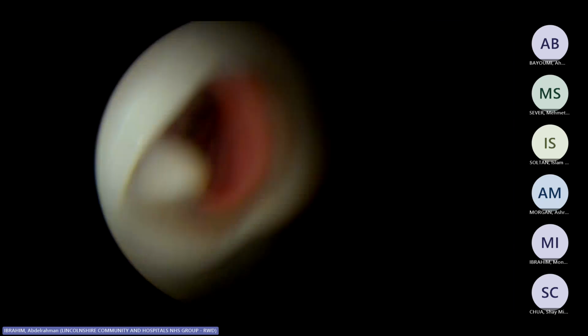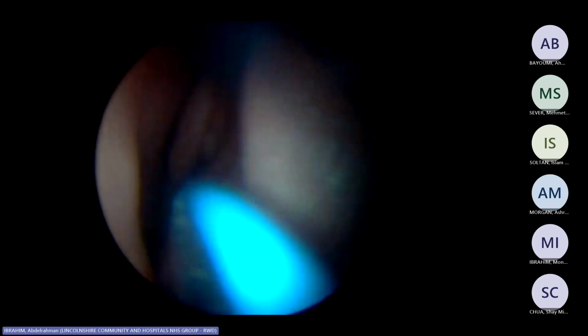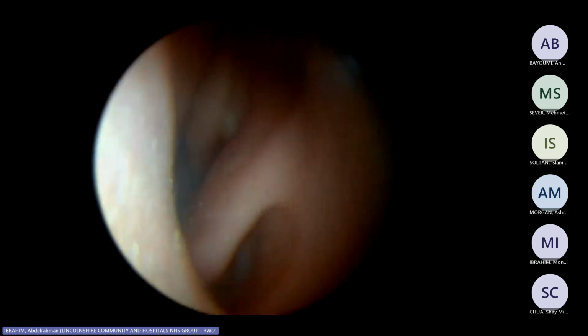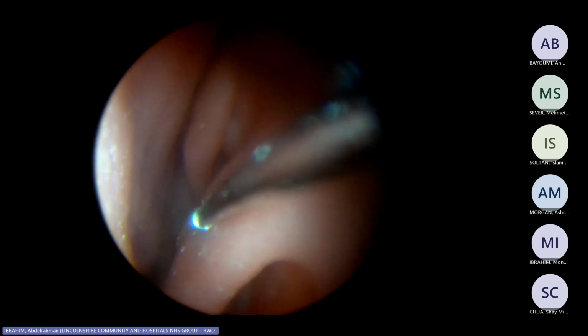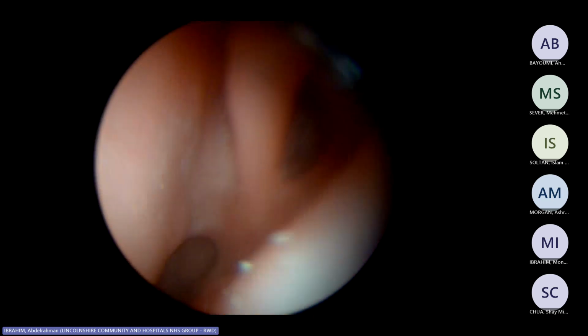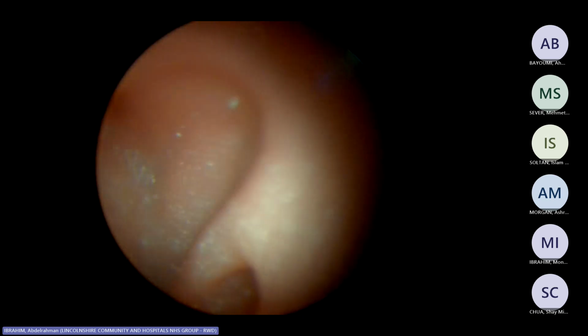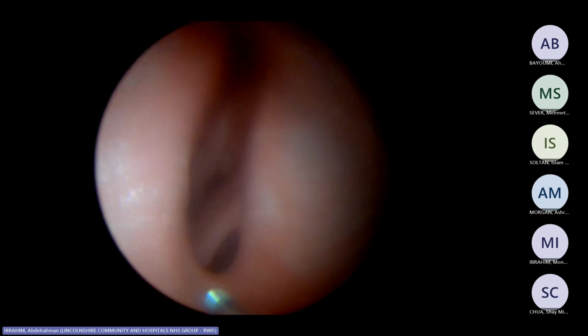Okay, so basically, this is the normal. You can see this is the nose. I'll just use it for some anatomy. This is the inferior turbinate, this is the middle turbinate, and down here is the opening of the eustachian tube, okay? So simple.